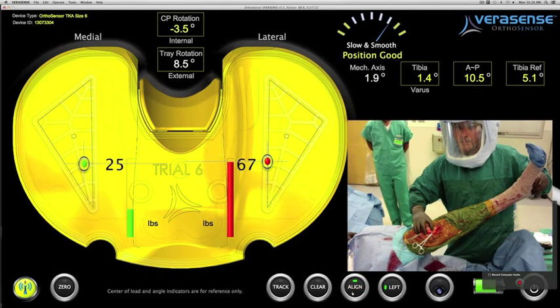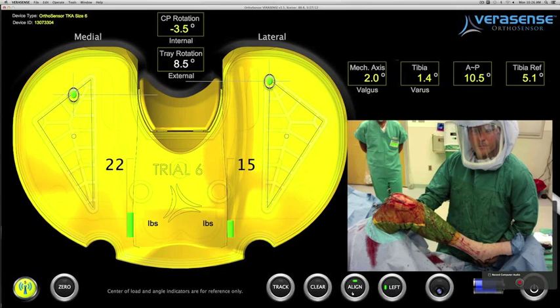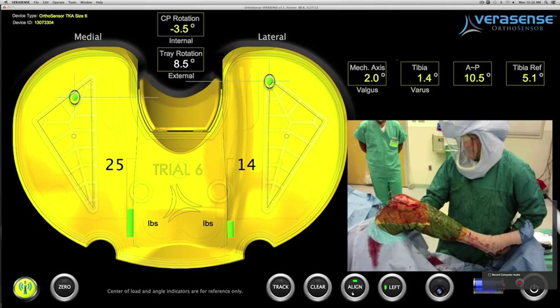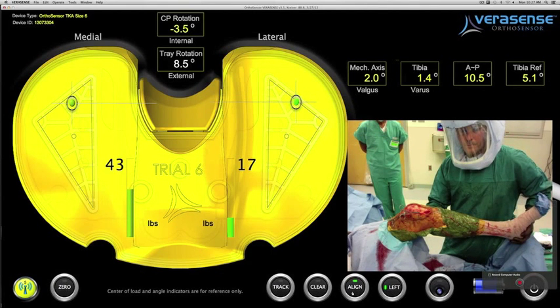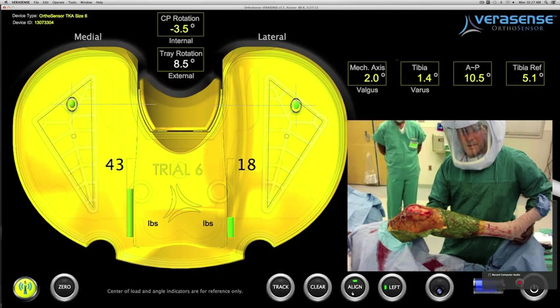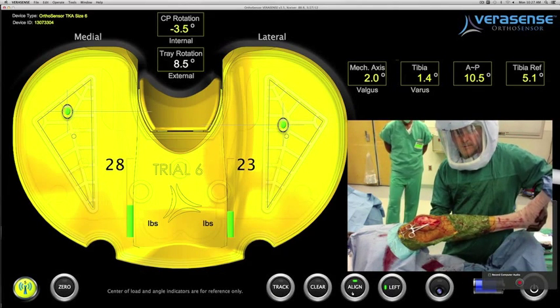The knee is now taken into extension, stabilized, and the leg is rotated off the hip joint. The mechanical axis has been improved to 2 degrees. He now has improved optimized contact points and improved flexion and mid-flexion. However, when he gets further into extension, he still sees some tension on the medial structures.